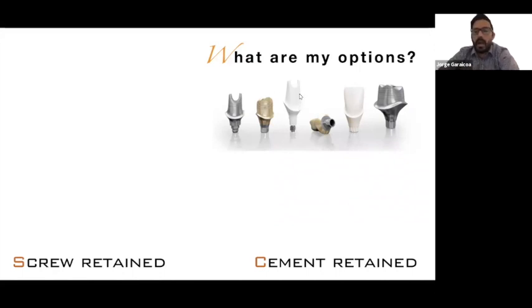Okay. Now we are moving away from doing this type of prosthesis just because we don't want the contact of zirconia with the titanium implant connection. We just don't want that direct contact of the zirconia with the titanium, because we know that the zirconia is so strong, so tough, that the micro movements of the abutment and the restoration will create some wear of those internal threads. And that is very obvious to see. If you have worked with these abutments before, you can see that even just trying in the crown and trying the abutment, you will already see marks around the abutment.